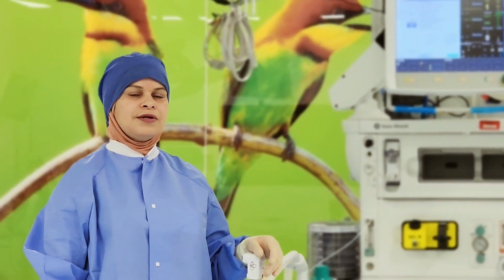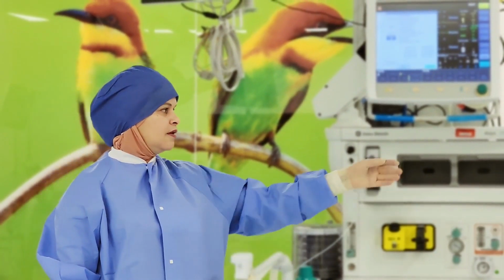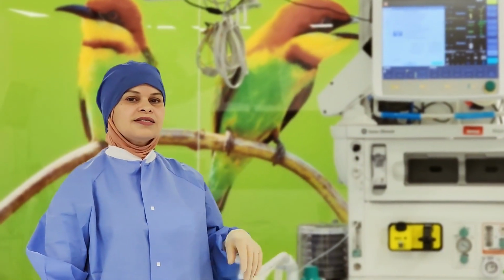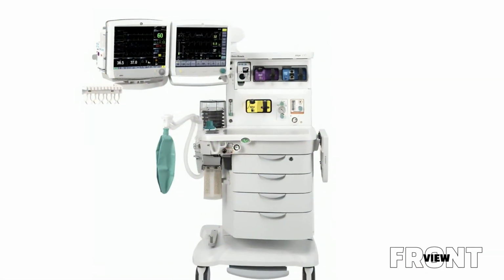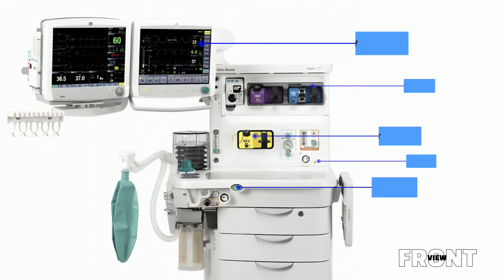This video offers an overview about how to operate Aisys CS2, including self-test, added features and safety. Here are some of the main components of this anesthesia machine.